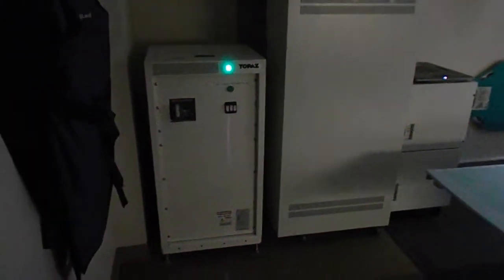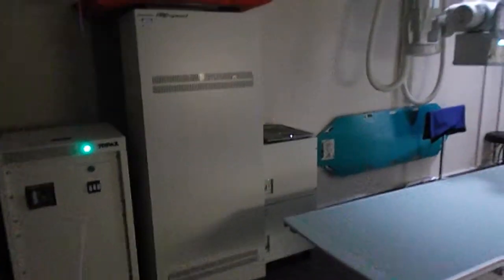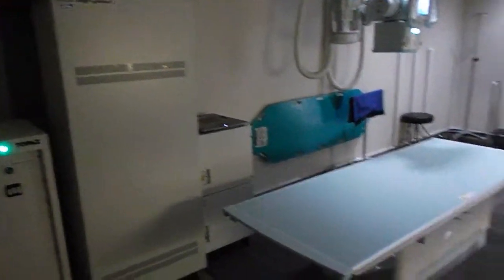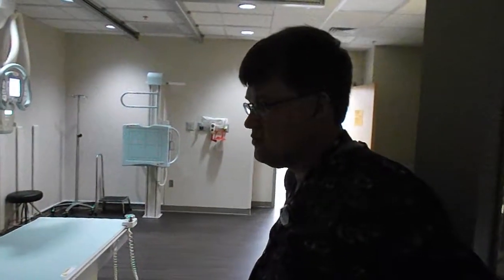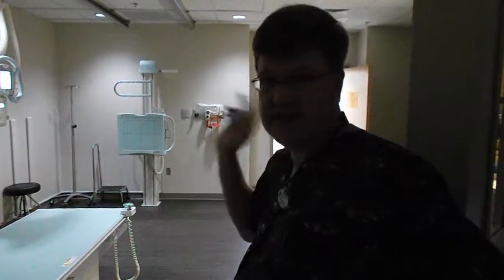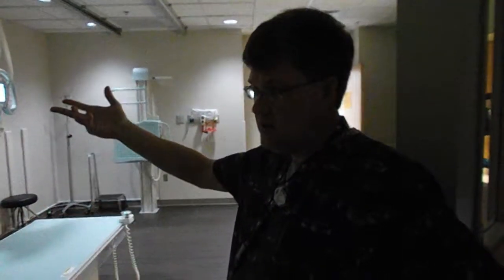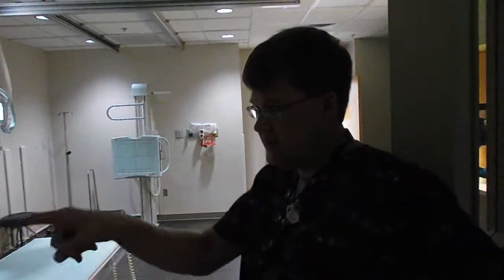So this rig over here that you were showing us — that is a line voltage compensator. Sometimes we'll have loss of power due to thunderstorms. We've had wrecks that have taken out power poles, stuff like that. So any time we lose the power, it switches over to the generators that the hospital has. You've got to hit that reset to get that back online.